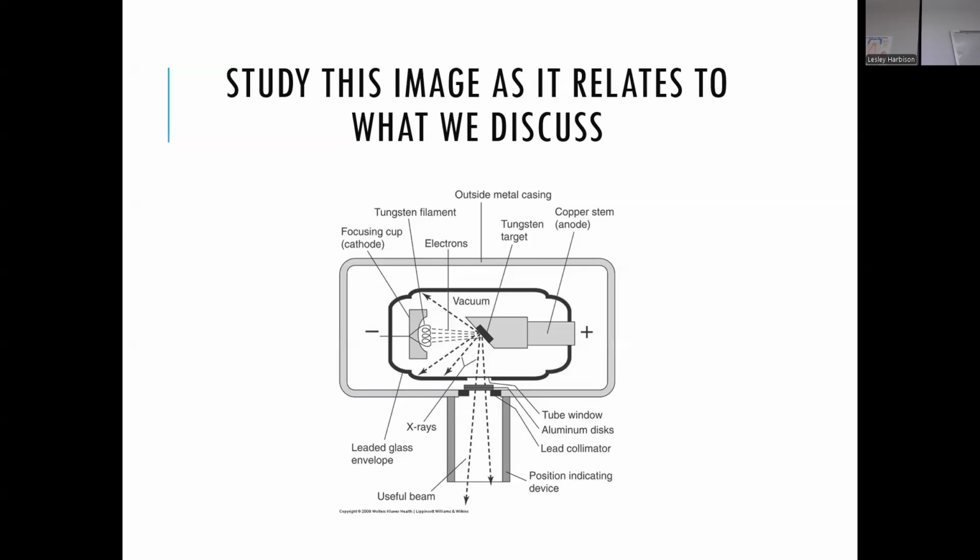And then this right here. So I apologize. That's why I need a projector. Do you see the little rectangle that's embedded in that slanted end where it looks like stuff is flying out? That's the tungsten target.